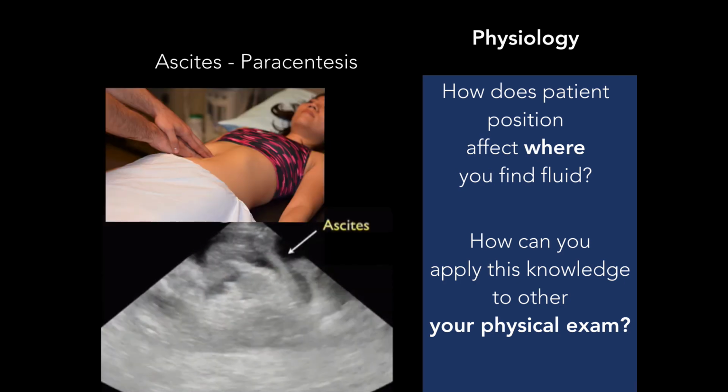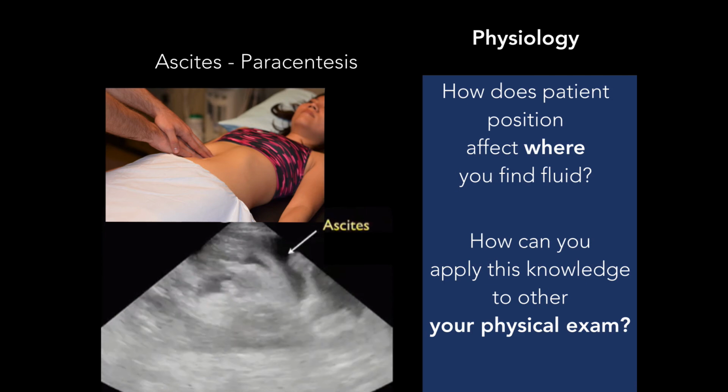All right. What about if you had ascites? How do we know what the fluid is? Now, we said we use our brain, right? But what if you weren't sure? What would you do? Aspirate. We stick needles in things, right? We got to get some of it.